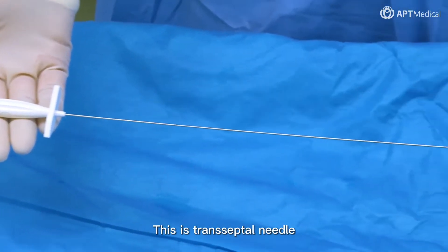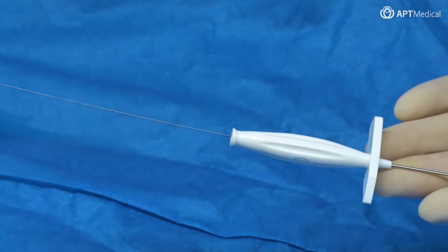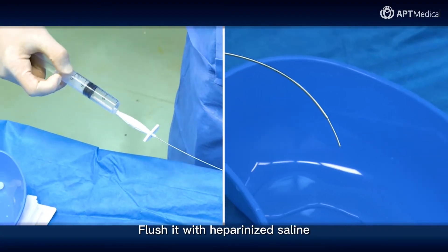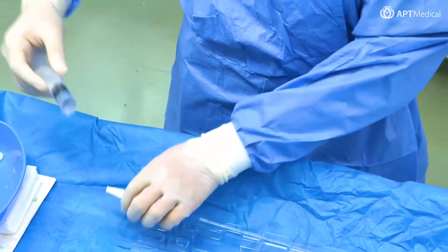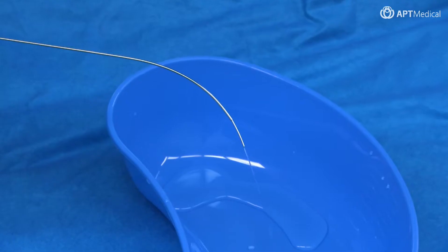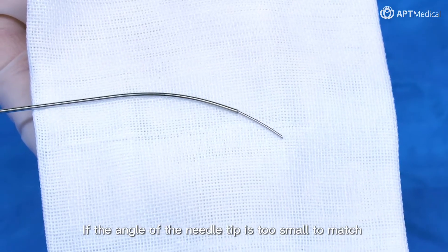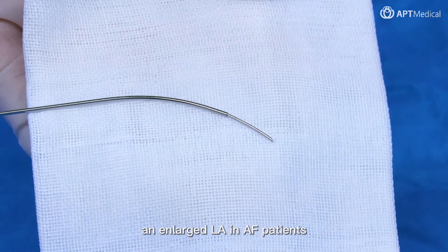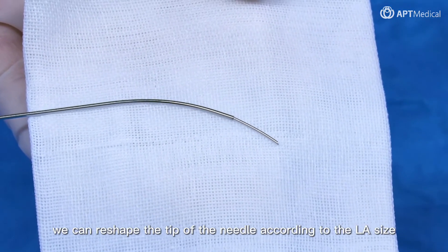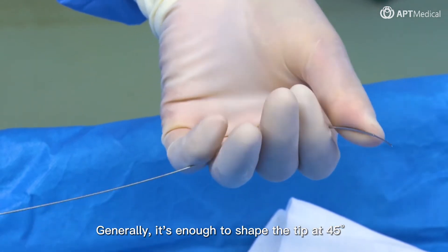This is the transeptal needle. Flush it with heparinized saline. Connect contrast medium and inject slightly. If the angle of the needle tip is too small to match an enlarged LA and AF patients, we can reshape the tip of the needle according to the LA size. Generally, it's enough to shape the tip at 45 degrees.